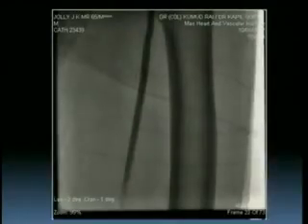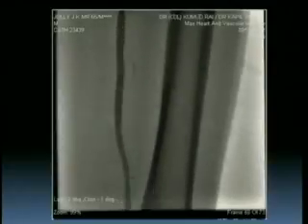This is the angiogram showing that the femoropopliteal segment was pretty clean. Then we used a 45 centimeter sheath and took an angiogram, and we can see a complete blockade at the popliteal trifurcation: anterior tibial artery, TP trunk, and posterior artery are all occluded. It's all collateralized. We tried to go from above, but we were never able to get into the true lumen of the posterior tibial artery or peroneal artery from above.